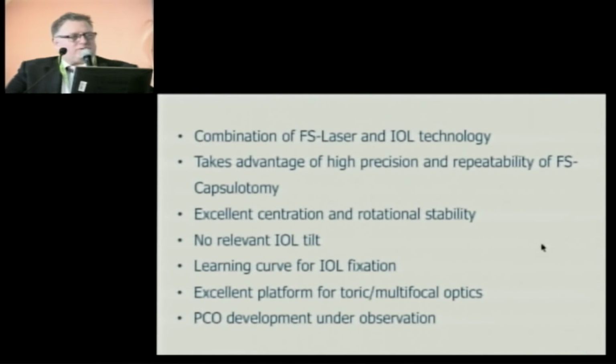So here we have a combination. I think it's quite an innovative concept to combine femtosecond laser technology, take advantage of it, and apply that to IOL technology. The high precision and repeatability of the femtosecond laser capsulotomy is the point. We have excellent centration, rotation, no tilt at all. But there's a learning curve for the surgeon to fixate that in a good way. But it's an excellent platform if you look at this for toric or multifocal optics.